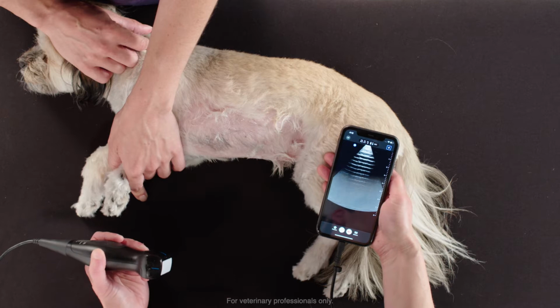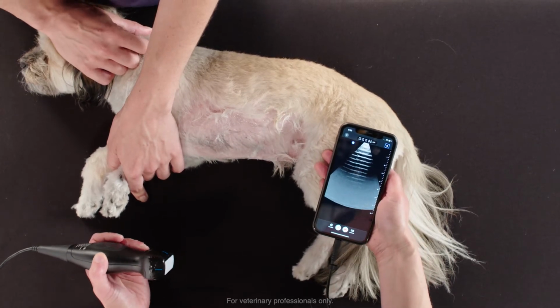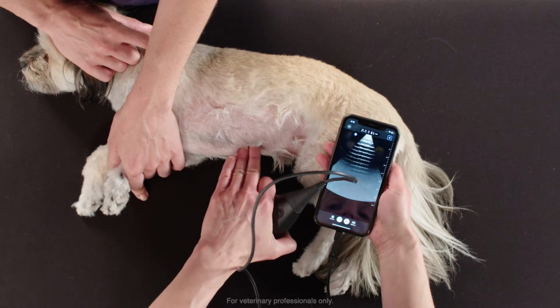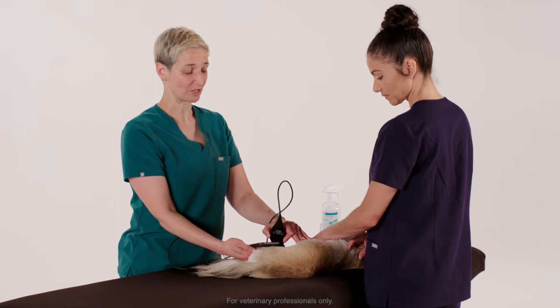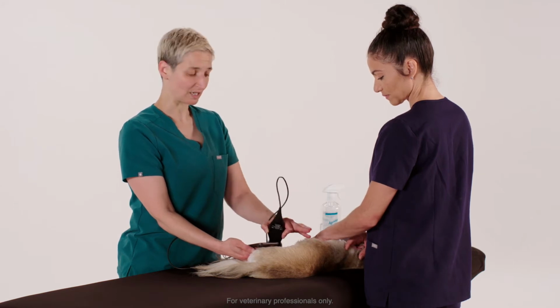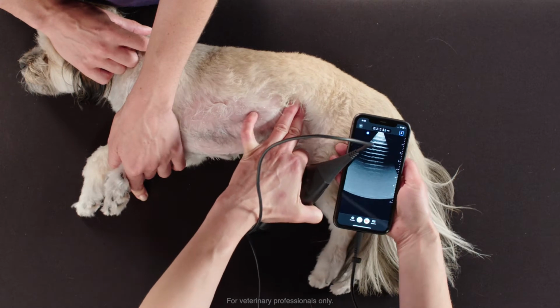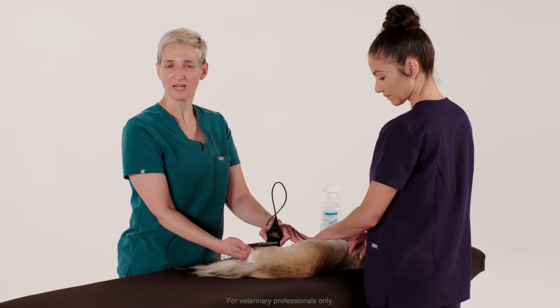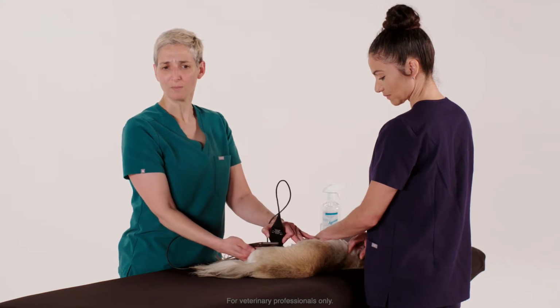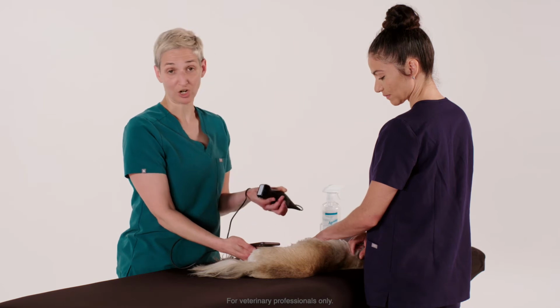Home base for me is going to be the liver. The liver can be imaged either from a sort of subxiphoid position or can be imaged through an intercostal position. In right lateral recumbency in a dog like Luna, where her rib cage actually comes back quite caudal, we're going to go for an intercostal approach to try to get a kind of a global, quick shot view of the liver to start our scan.